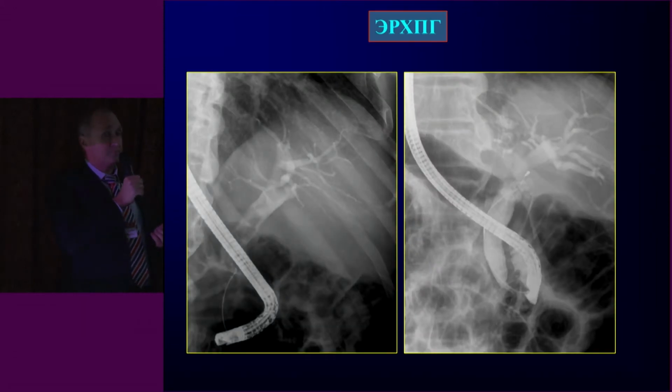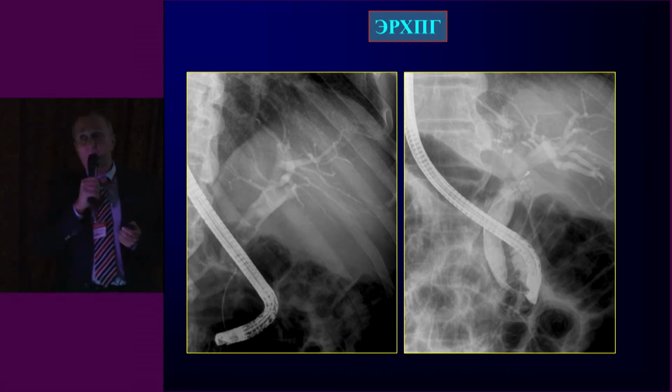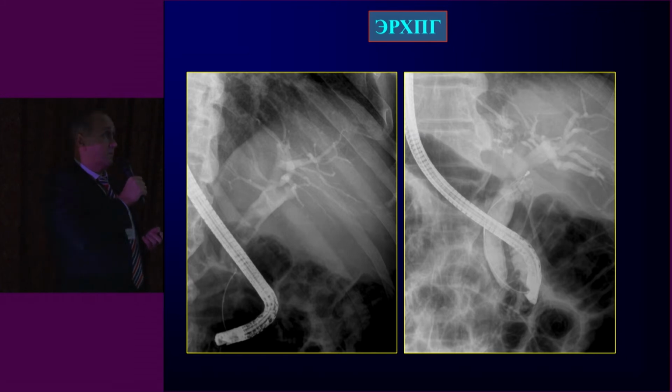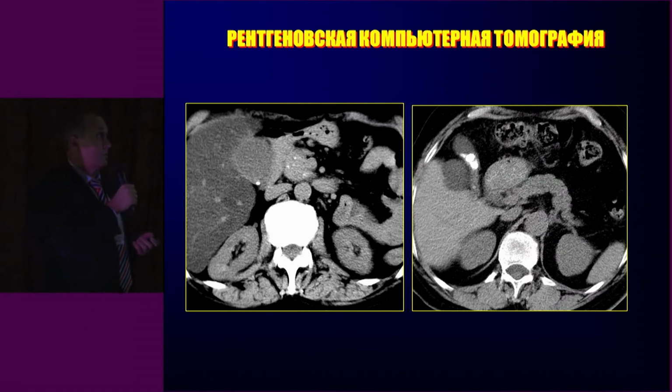And concerning the biliary system, we see strong progress of the method of computer tomography. And you saw it in lectures, and you know that ERCP has lots of positive sides. It's a high resolution. You can easily diagnose those filling defects, and as Professor Larger said, the most important, this method makes it possible to combine diagnostic and therapeutic interventions.